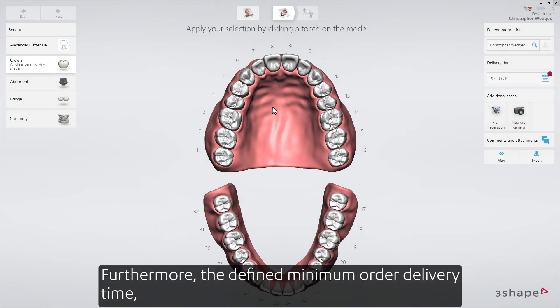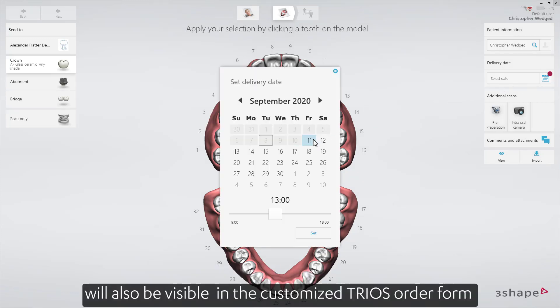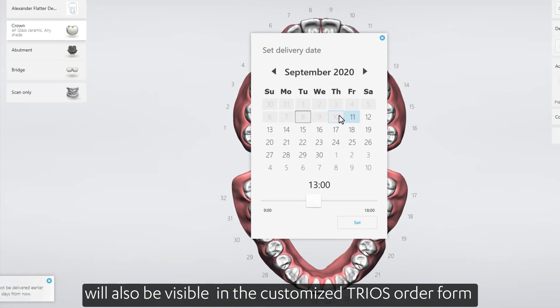Furthermore, the defined minimum order delivery time will also be visible in the customized TRIOS order form.